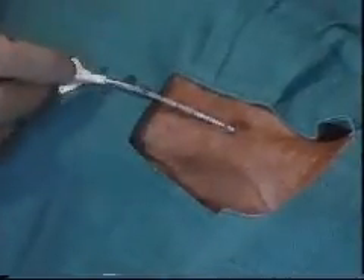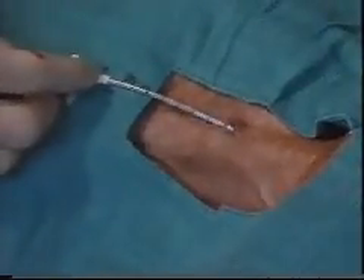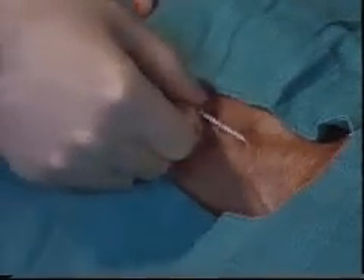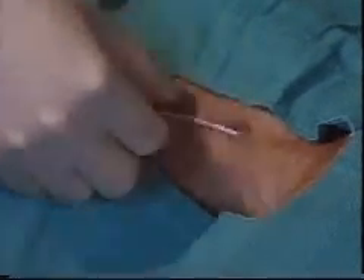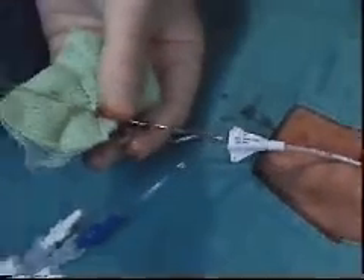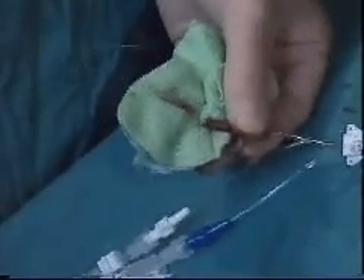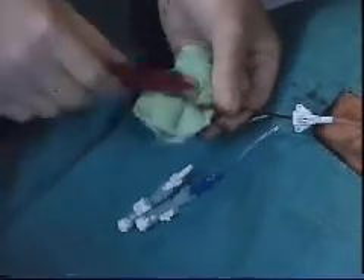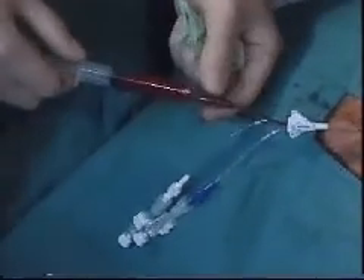The catheter is then introduced into the vein. It is about 20 centimeters long and in this case is advanced to about 15 centimeters. The wire is carefully withdrawn and aspiration of venous blood is confirmed in the syringe.